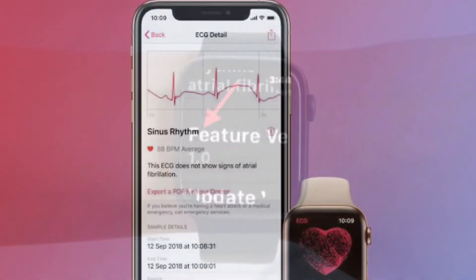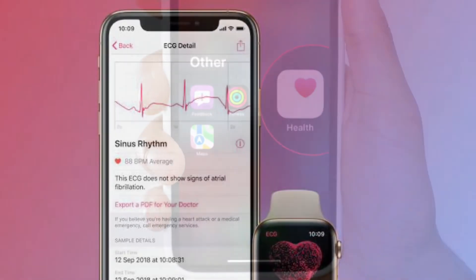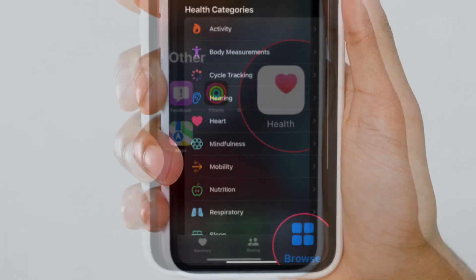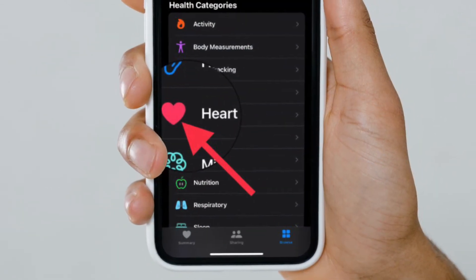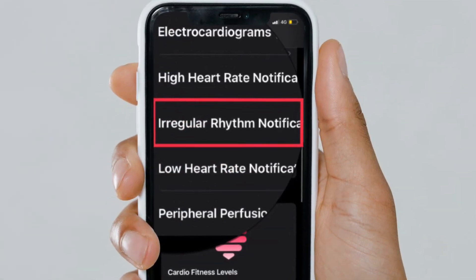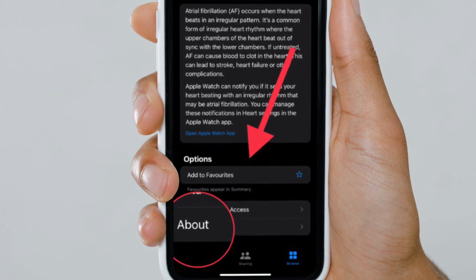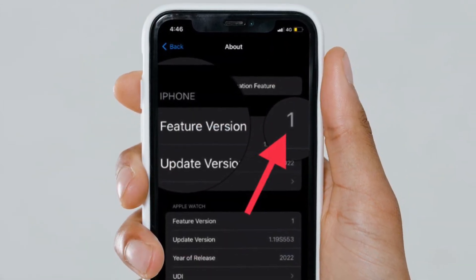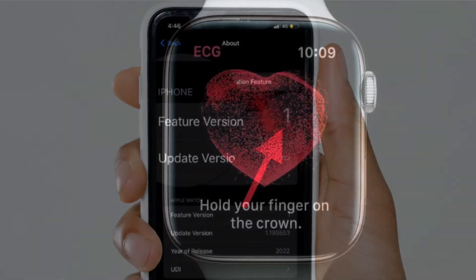It's worth pointing out that you can also get it done using your paired iPhone. To do so, open the Health app on your paired iPhone and then tap the Browse tab. After that, scroll down and tap Heart. Then tap Irregular Rhythm Notifications. Then scroll down to Options and then tap About. The version number of the irregular rhythm notification is listed next to Feature Version. That's all there is to it.